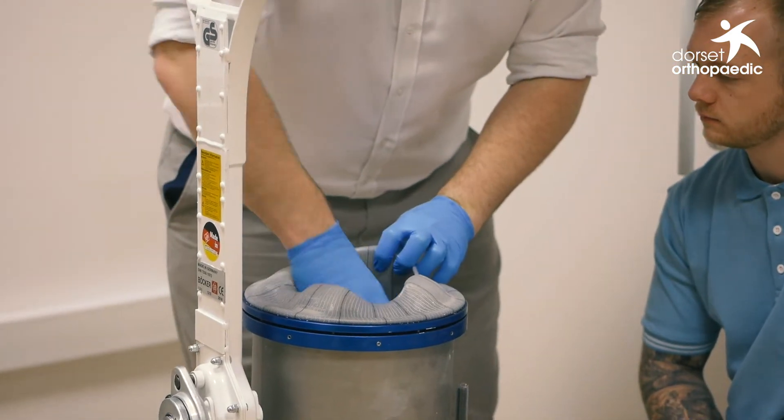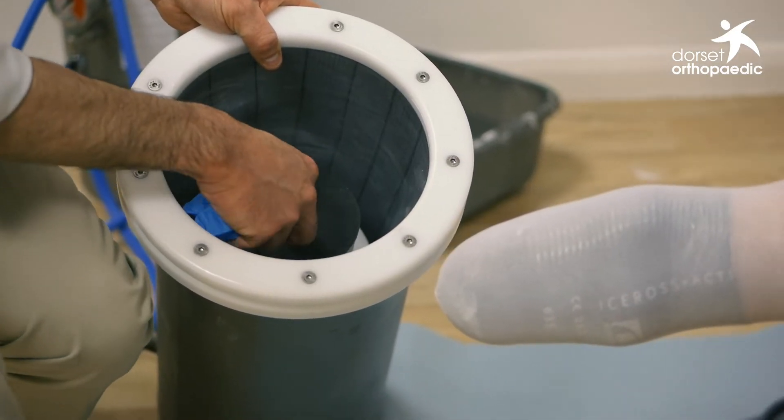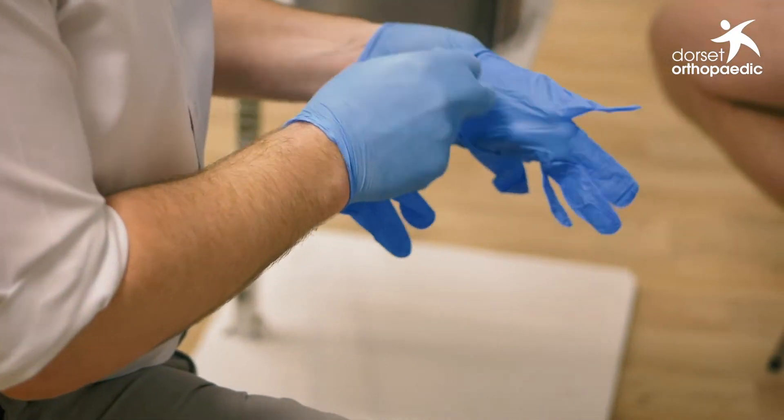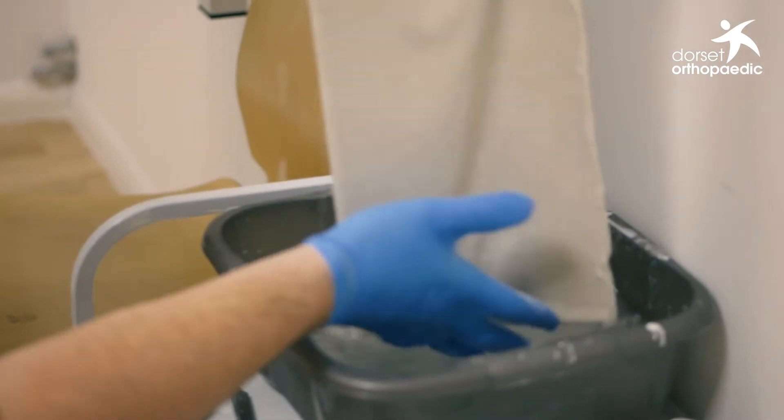The way we take a cast with the AquaSymphony system is we ensure that the distal former — which is made of foam with solid plastic below it — is set to the correct height for that individual's residual limb. We then set them up within the AquaSymphony cylinder once the setup is fully correct and aligned, and we wrap the individual's stump in plaster bandage as we normally would for a cast.